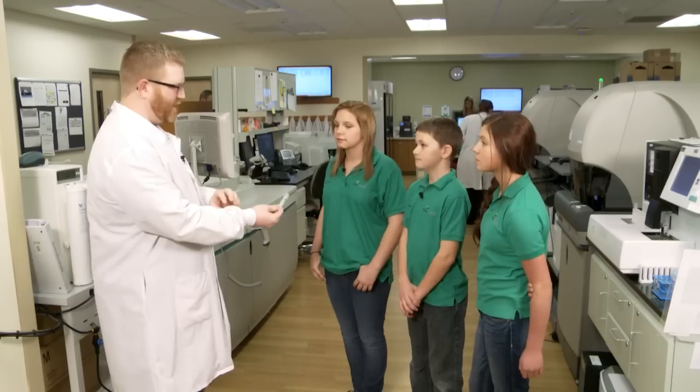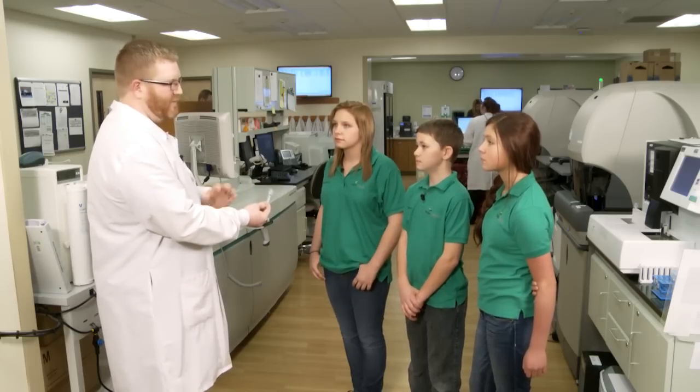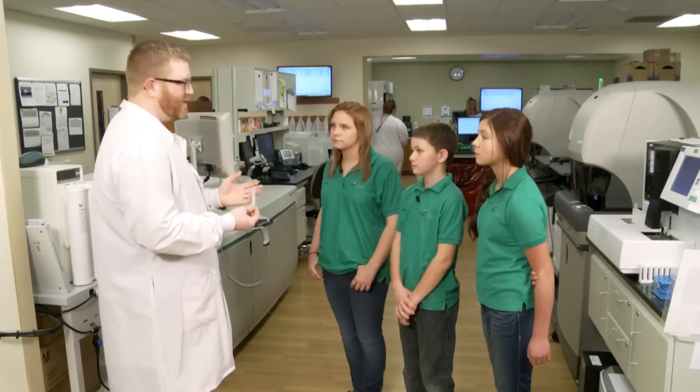Does it just keep coming out and coming out? No — it stops. It scabs. Exactly. So we can tell if your blood is going to stop flowing and form a scab. If this is abnormal, you might have a bleeding condition and the doctor would have to treat that.